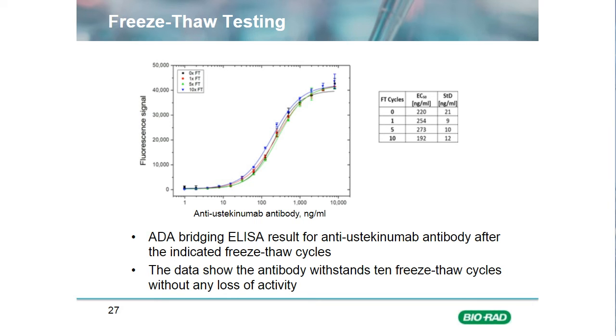Now, I should mention that in this slide and the previous one, both of these studies were looking at the evaluation of mammalian-expressed IgG HuCAL antibody, and the assay was actually formulated as an anti-drug antibody with the IgG as the positive control. So not only can your critical supplier carry out the stability test for you, they can also do it in a format that may be relevant to your intended application.